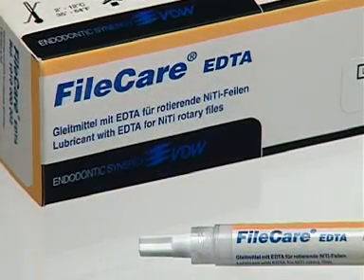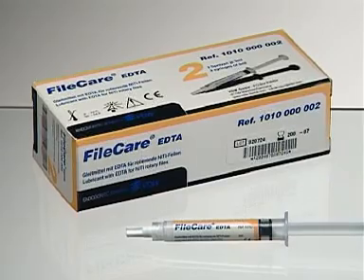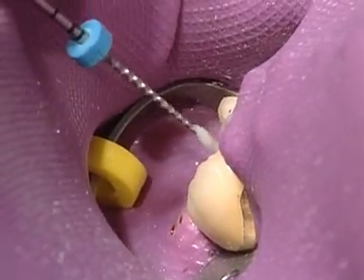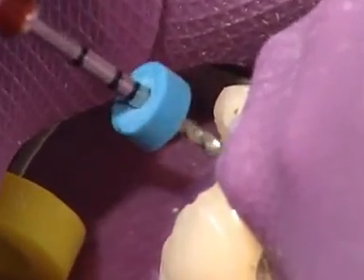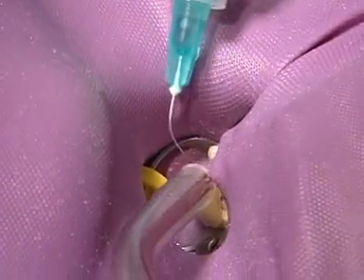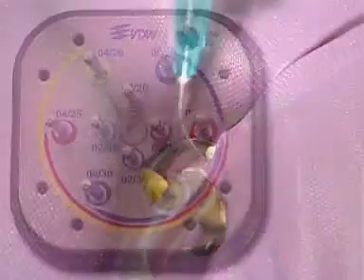An important aid in root canal preparation is a chelator containing EDTA, such as FileCare EDTA, to remove smear layer and open dentinal tubuli. The file is coated with some FileCare EDTA before being inserted into the canal. The file is inserted into the canal and applied with slight pumping movements for 5 to 10 seconds. Endo-IT Professional monitors the optimal torque and speed for each file. This maximizes efficiency.